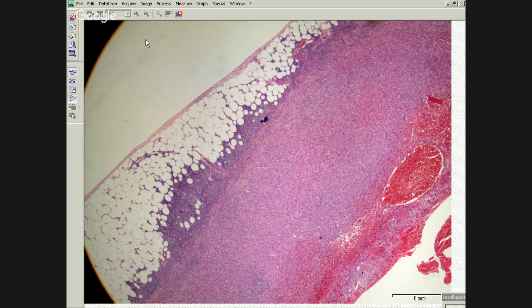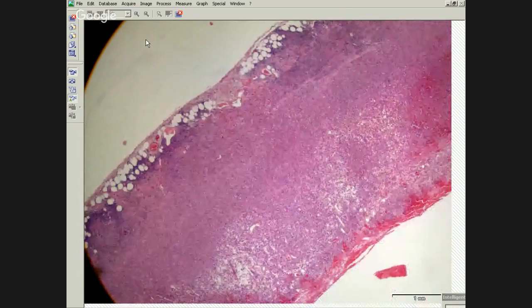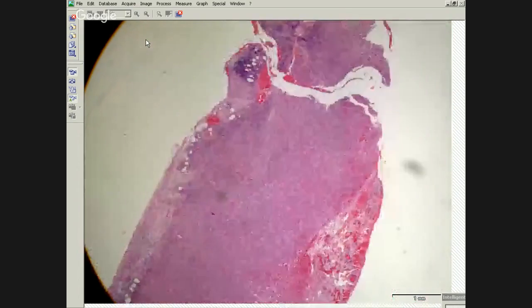No, and you want to be careful about that, particularly when you have a peritoneal biopsy that's superficial, because you may just get the exophytic bit of the papillary. That's when you really want to correlate with your radiology as well. If you've got someone with diffuse caking of the omentum and tumor all over the place, and you just have a few little papillary fronds, you don't want to call that well-differentiated papillary mesothelioma. Okay, so here we've got another 65-year-old guy with diffuse pleural thickening.